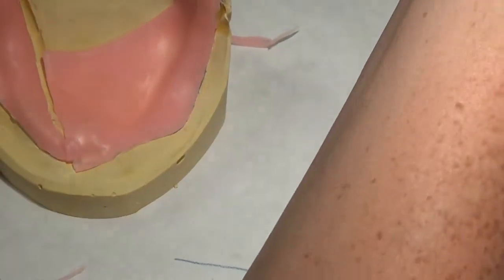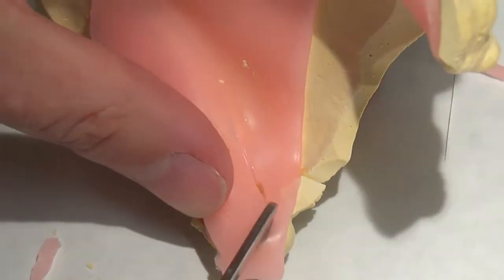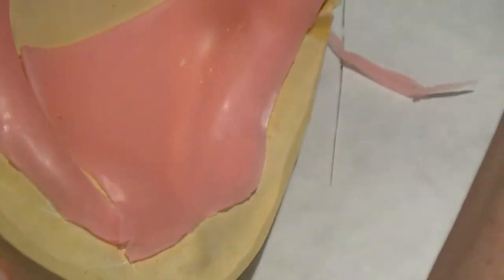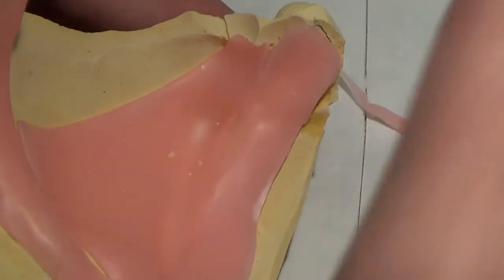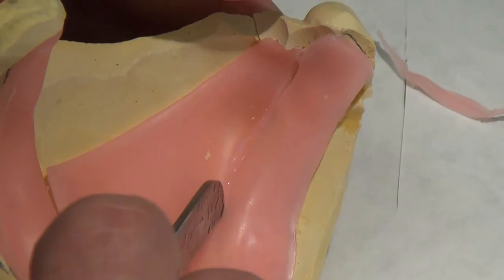While it's warm, it peels a lot easier — it doesn't fracture as much on you. This patient has a lot of resorption. You all know anatomy enough to know where the mandibular nerve is. It runs right along — the inferior alveolar nerve runs all the way along this area.